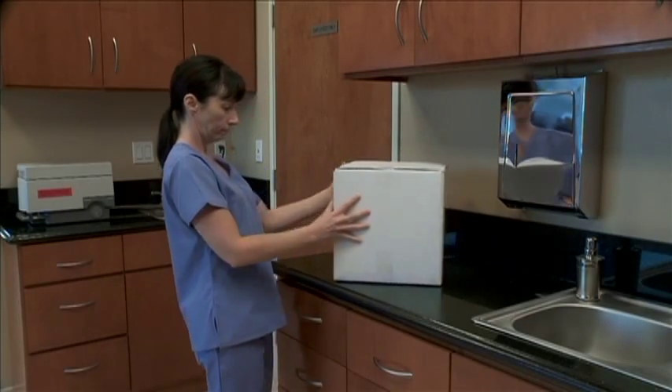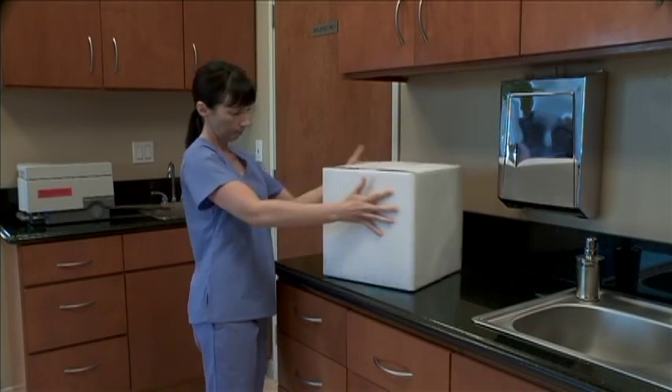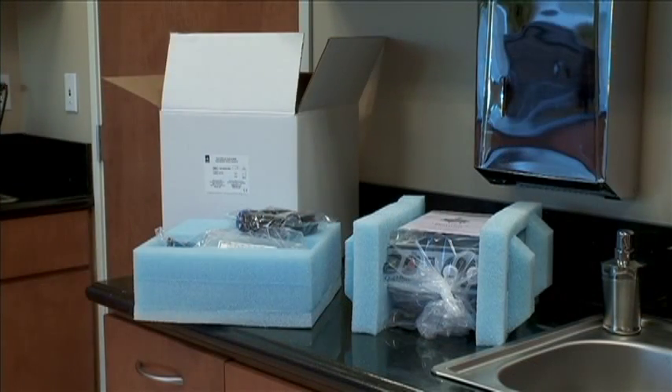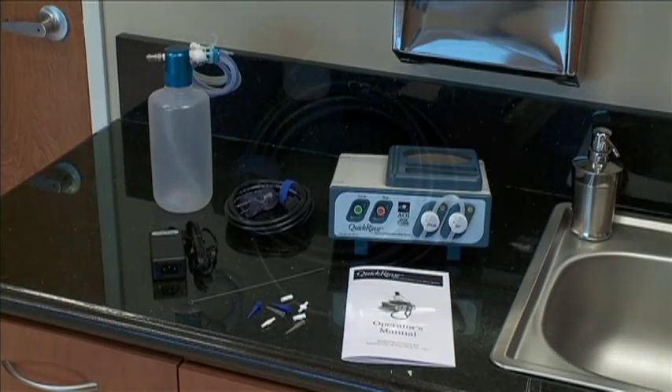When first receiving your Quick Rinse system, inspect the box for shipping damage. Next, open the box, unpacking and accounting for the following documented contents.